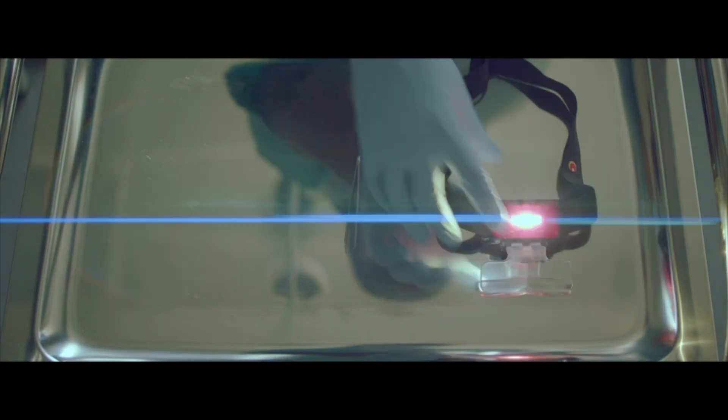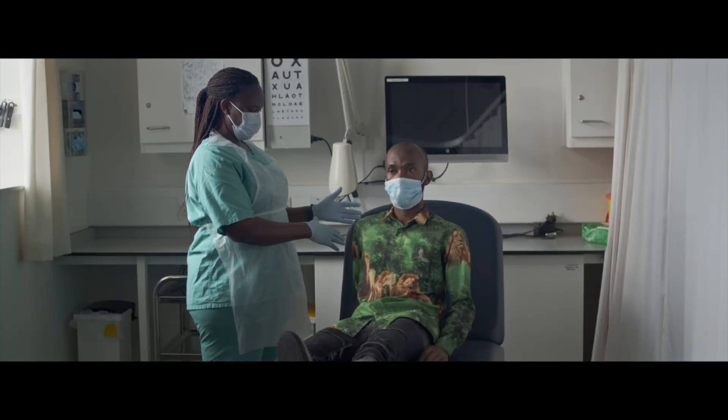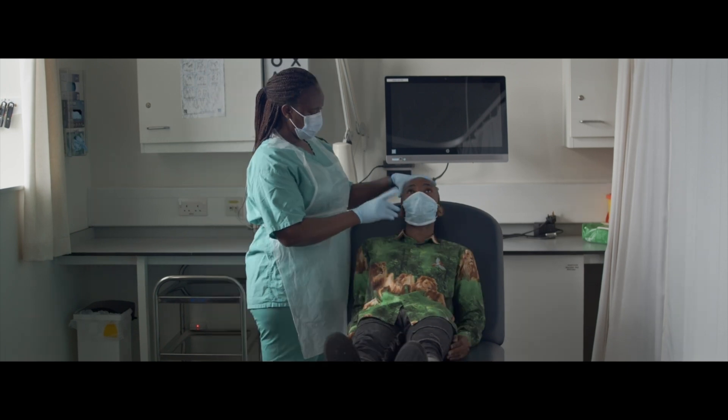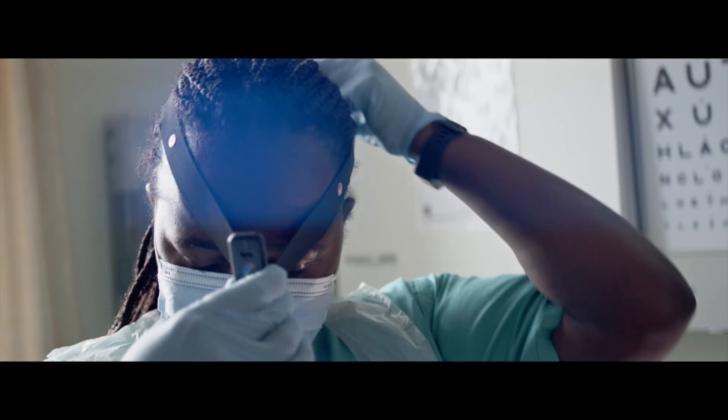If using a hands-free head torch, then lie the patient down flat, face up. Remind the patient to keep their head pressed backwards against the bed and not to come forward or roll side to side.